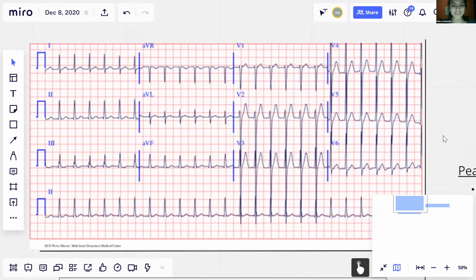So I'm nervous right now, but the first thing I learned is that when I have any kind of arrhythmia, I have to assess if the patient is stable or not. So first, I would like to see if this patient has edema or any crackles, if she has dyspnea, what her pulse and oxygen saturation are, and if she has taken any other medications. And as she is on telemetry, I would like to see all her vitals. After that, I see this EKG.